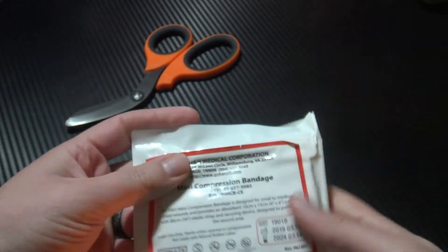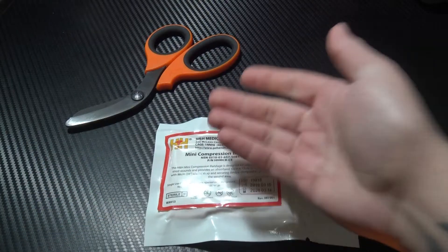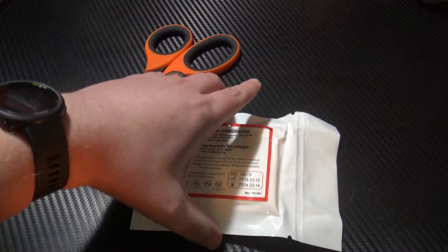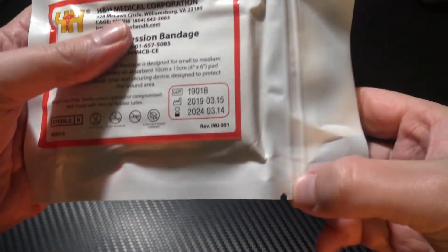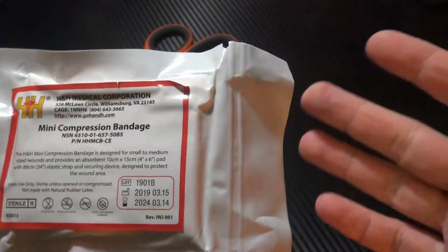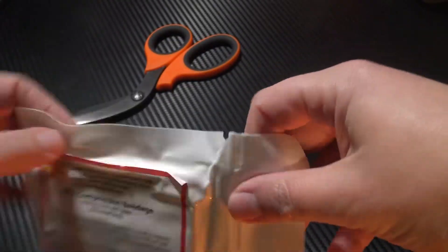So that's really neat — perfect for your handbag, glove box, back pocket, IFAK, whatever you want. Looking at the outside of the packaging, you can see you have the tear notches here ready to go. So if your hands are covered in blood, you're stressed, you've lost those fine motor skills, you're still able to open it no problem.